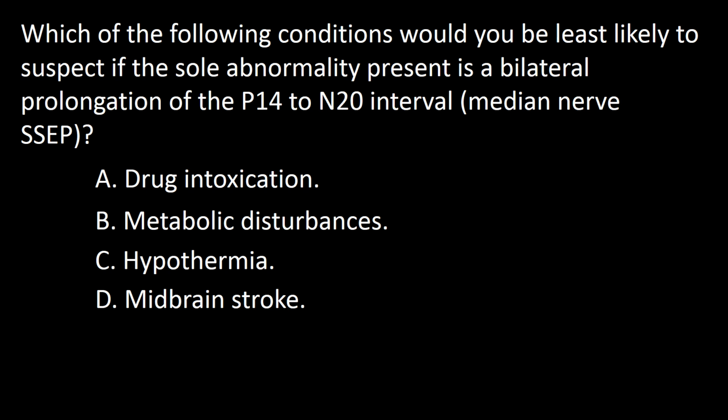Next question. Which of the following conditions would you be least likely to suspect if the sole abnormality present is a bilateral prolongation of the P14 to N20 interval? A. Drug intoxication. B. Metabolic disturbances. C. Hypothermia. D. Midbrain stroke.